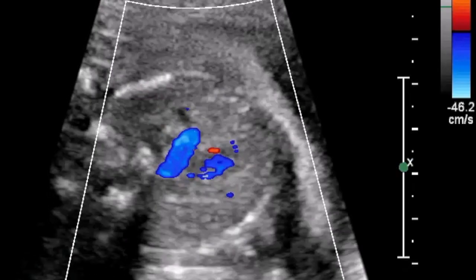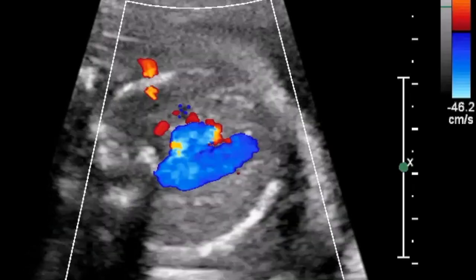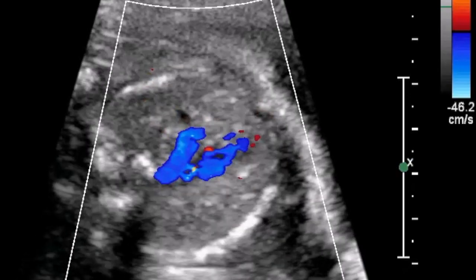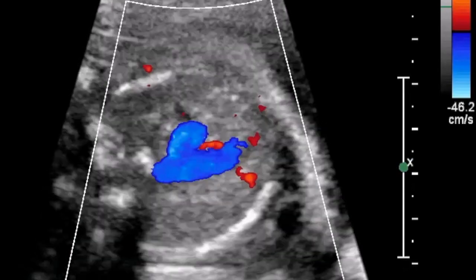Color Doppler reveals anteroposterior flow in both arches. The spine is posterior and the sternum is anterior, so blood flow always goes from the ventricles to the great arteries — posteriorly — and that's why both arches appear in the same color, which is blue. The SVC will be seen in red because it carries blood in the opposite direction. You also see the normally running right subclavian artery, which forms a cycle-handle kind of configuration. Normally there should be no vessel crossing posterior to the trachea.